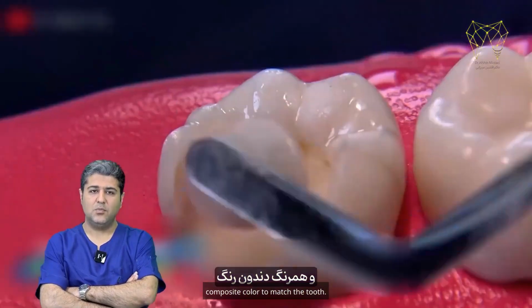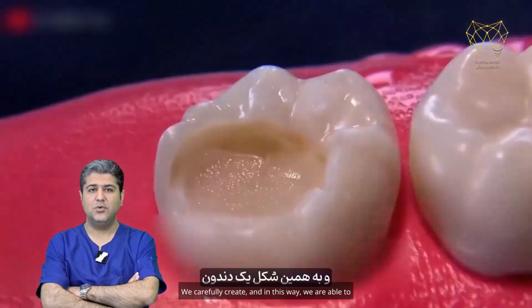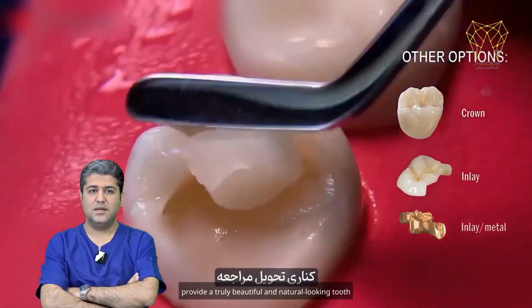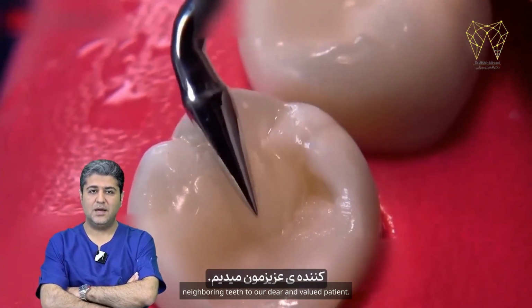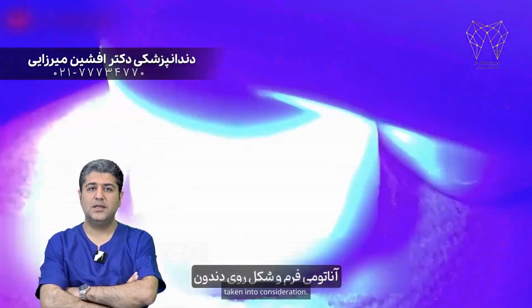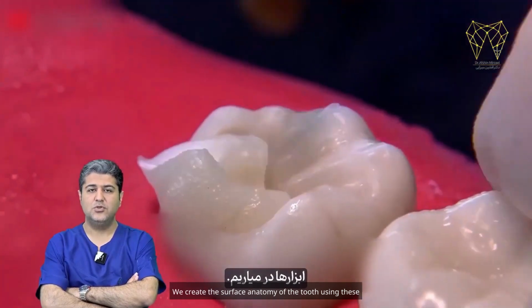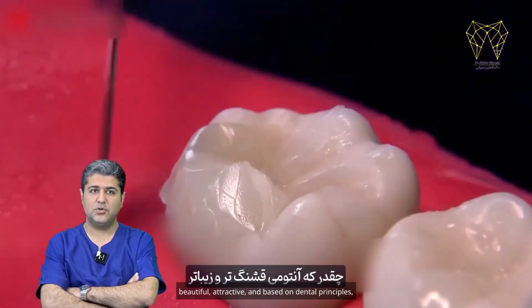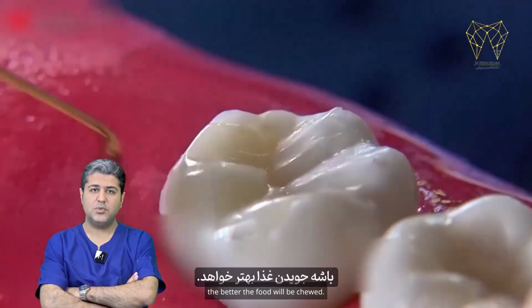and we select the composite color to match the tooth. We carefully create, and in this way, we are able to provide a truly beautiful and natural looking tooth that perfectly matches the color and shade of the neighboring teeth to our dear and valued patient. The anatomy, the form, and the overall shape are all taken into consideration. We create the surface anatomy of the tooth using these tools, and the reason is that the more the anatomy is beautiful, attractive, and based on dental principles, the better the food will be chewed.